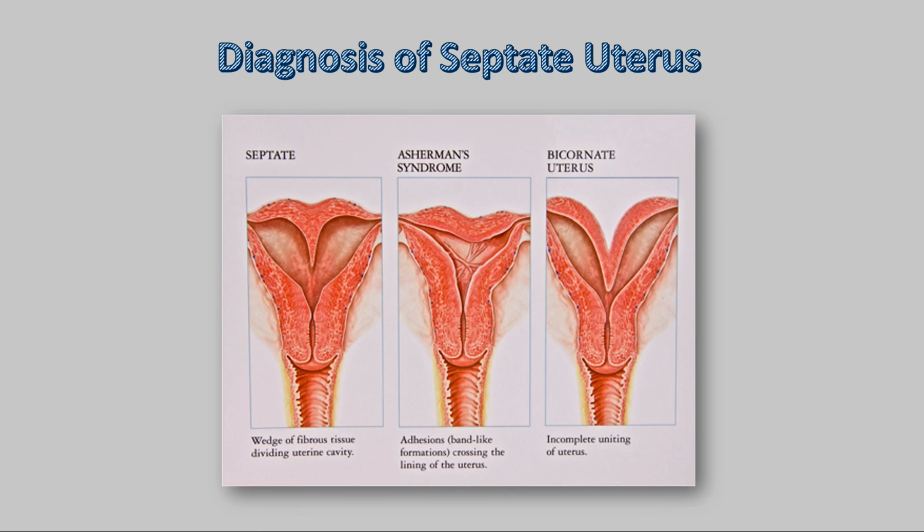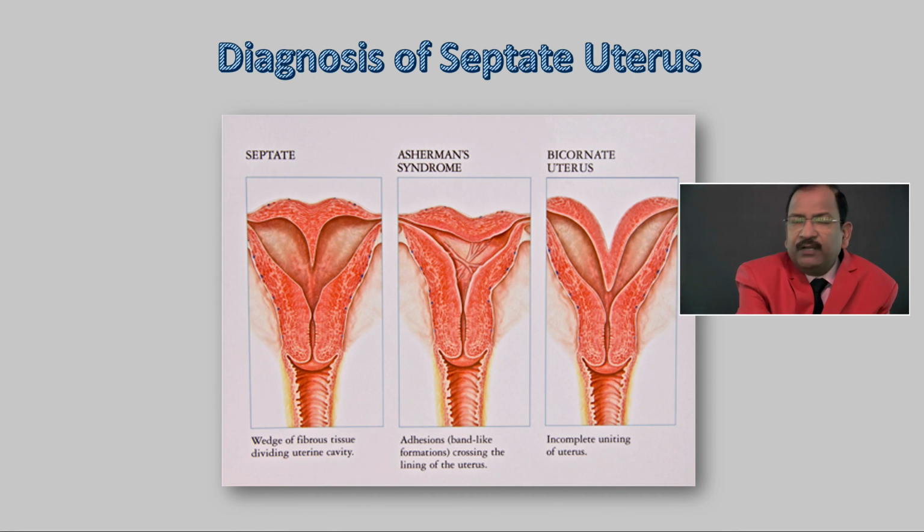You need a minimum of 400 watt for underwater cutting. Otherwise, it won't work, because underwater a higher wattage is required. But this will be cheaper. This 250 watt, if you buy an Indian one, will cost you only 50,000-60,000 rupees.